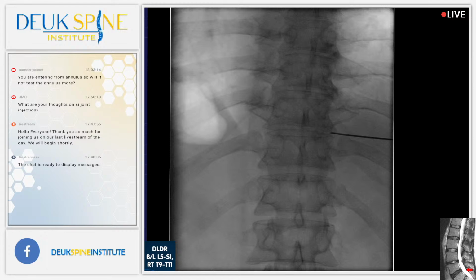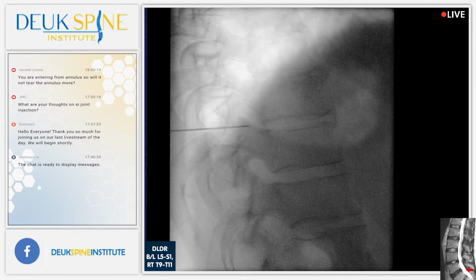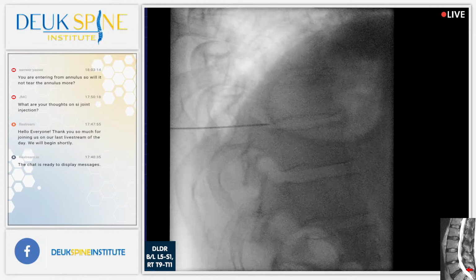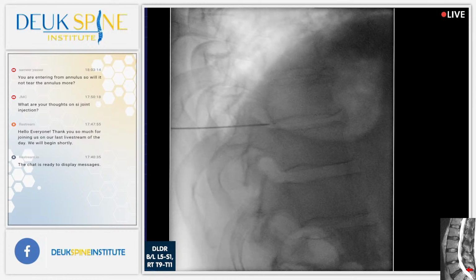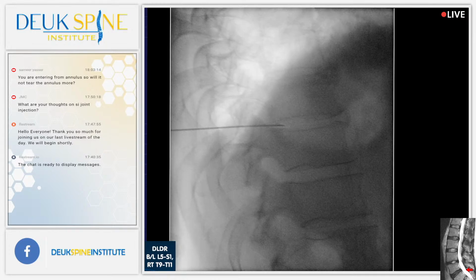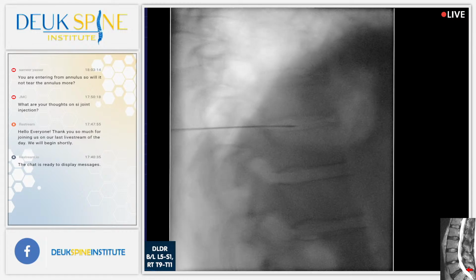All right. 12, 11, 10. How's he doing? Everything good? Shot? Right at the bottom there, you see that? I'm on the disc, but I'm at the bottom of the end plate on the disc. Shot? I've got to just see we're going into the disc right now. It's perfect. Doesn't get better than that.